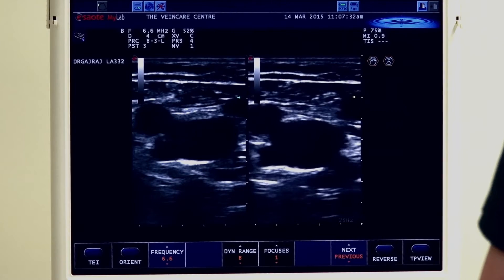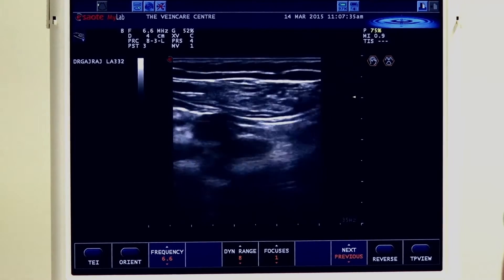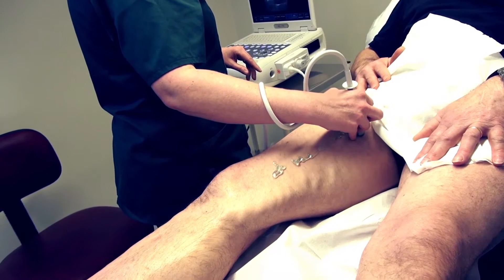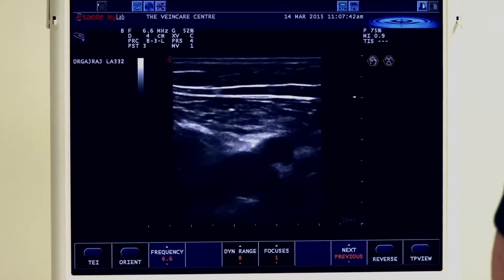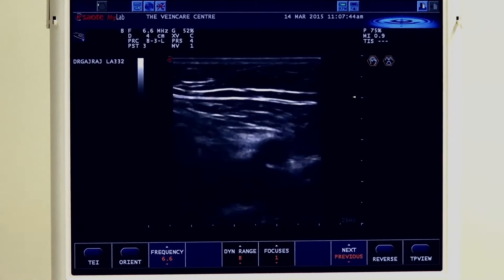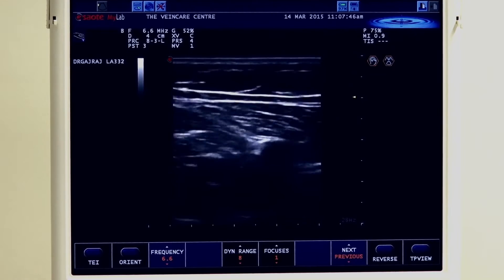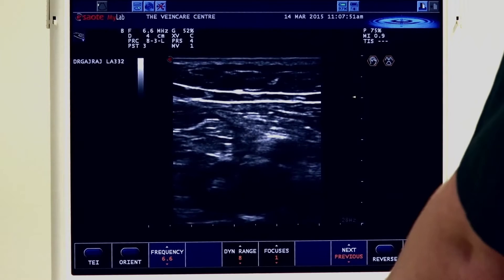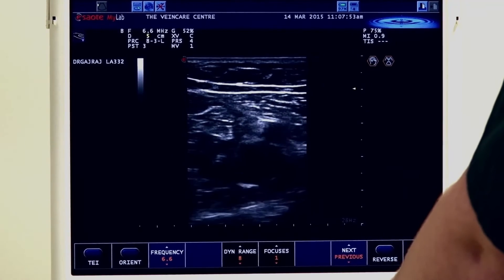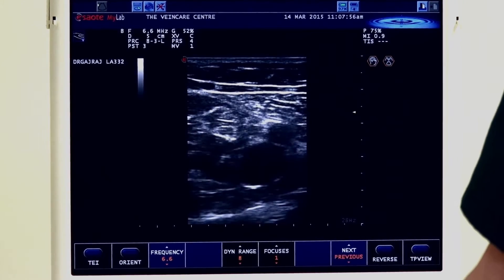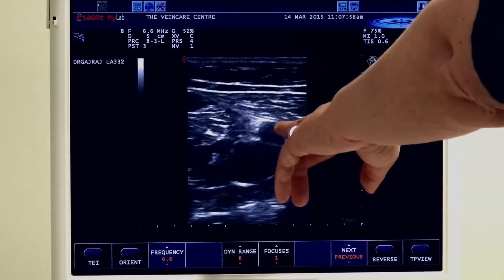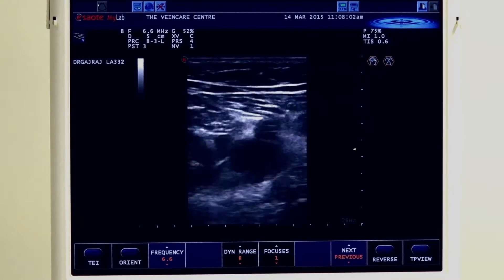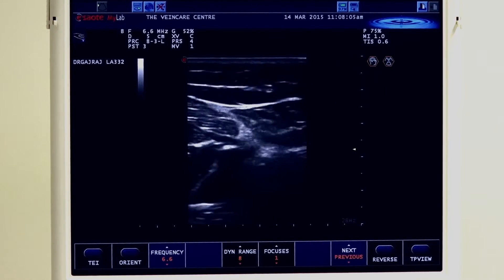We are going to work down the leg at one centimetre markers, compressing the common femoral vein into the femoral vein all the way down, and we can see beautiful compression. Any clot within that vein would prevent it from being compressible, and we would pick that up easily. Optimisation of the image is very important. We are getting deeper now down the femoral vein, with the little artery on top. We need our focal zone at the area of interest and sufficient depth to work our way down.